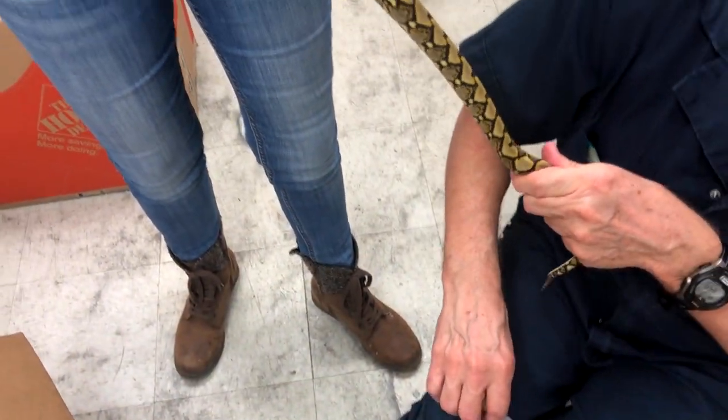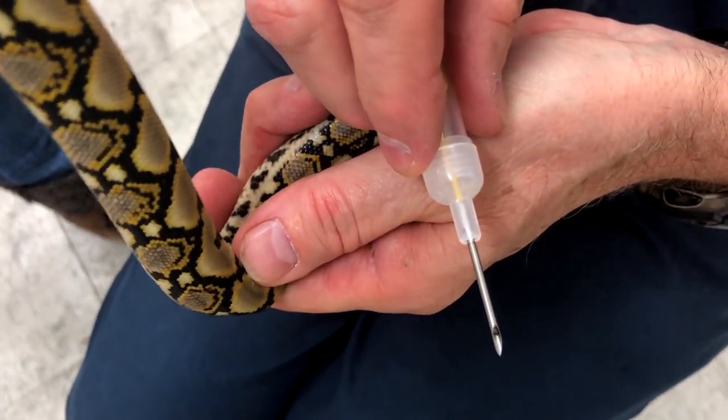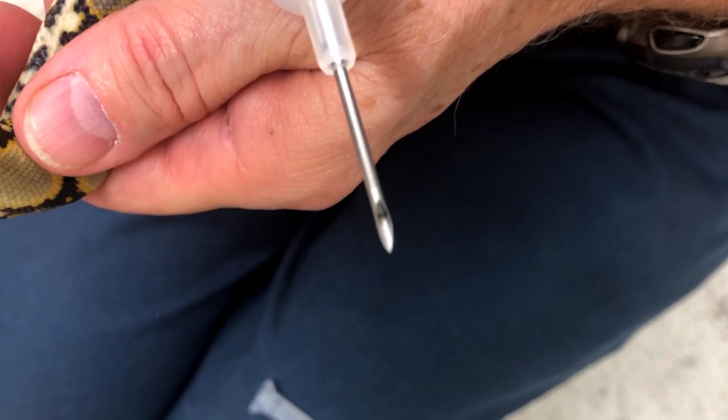There, you got him? Yep. Okay, so you can see the microchip sticking out of the needle there — that's what's going to go in.